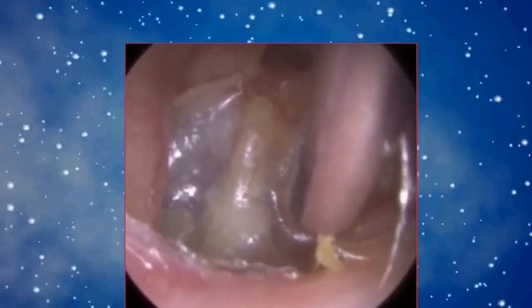I've got a feeling my narration is going to roll over. So I'm just going to go back to the ear in a moment and I'll explain the mastoid. So in front of us now, that's the eardrum. You can just see the hammer bone in the middle. Obviously, there's a lot of surgery, so it's not your normal appearance. You can see all I'm doing is moving skin, and I'll come back to that, why we're doing that, why it's important in a moment.